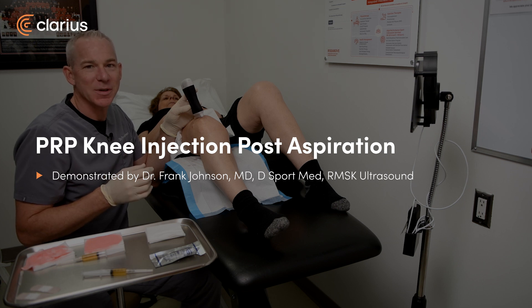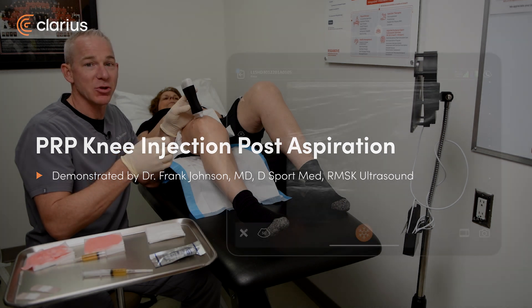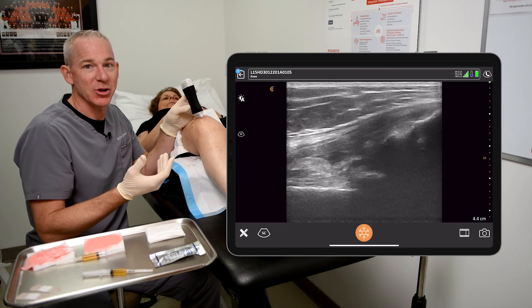Hi, Dr. Frank Johnson from Sports Medicine Ultrasound. I'm here to finish off a knee effusion aspiration and PRP injection.